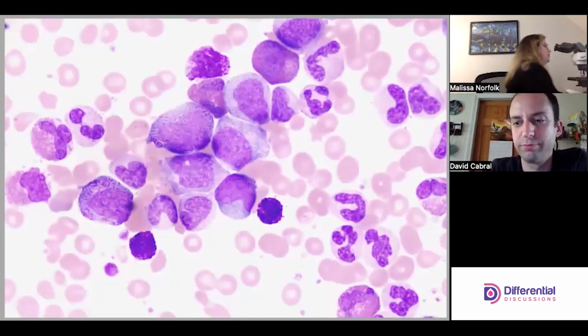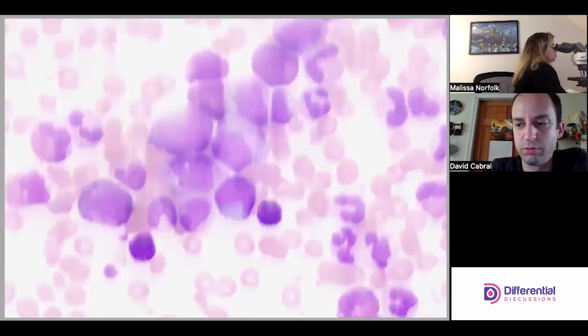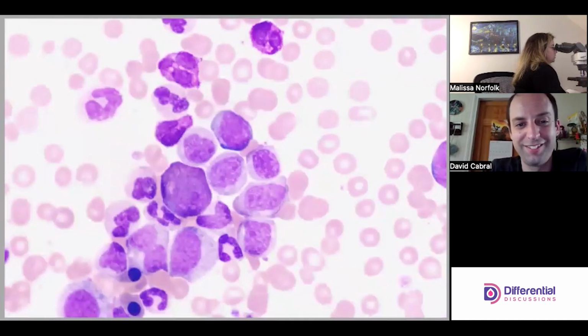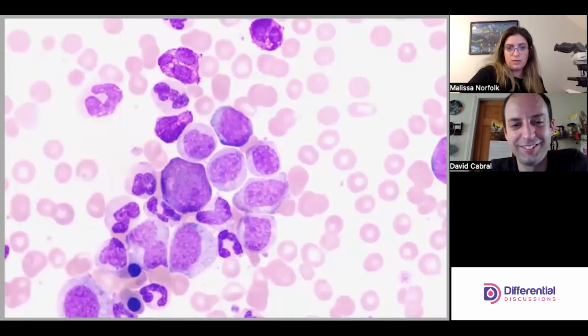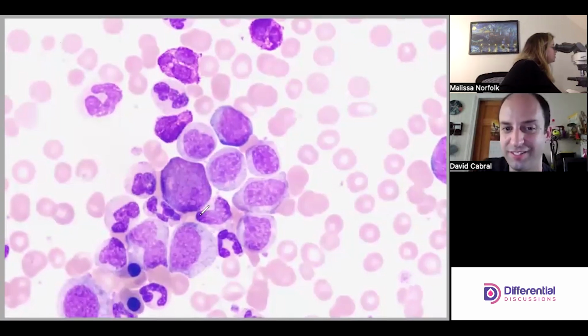All right, let's look at one more field. Sure. All right. This guy in the center is wonky. You know what?